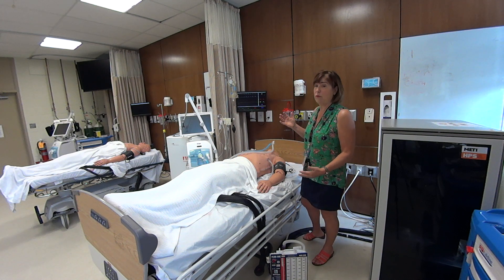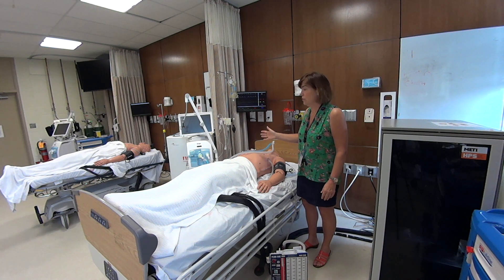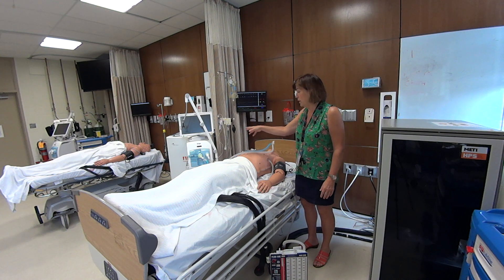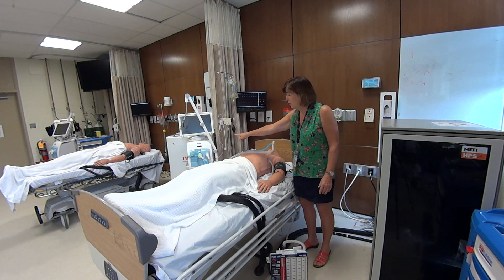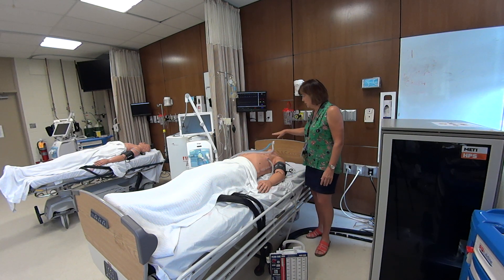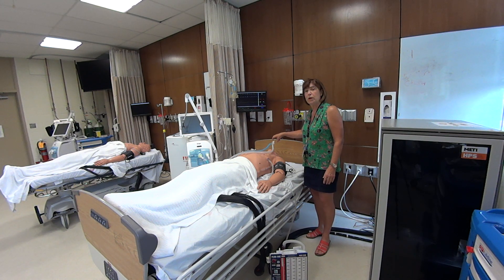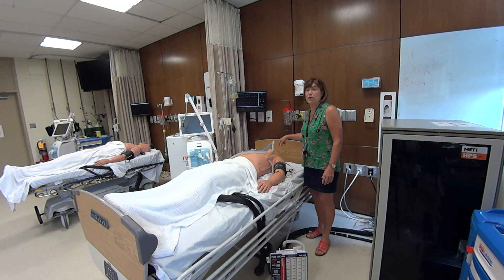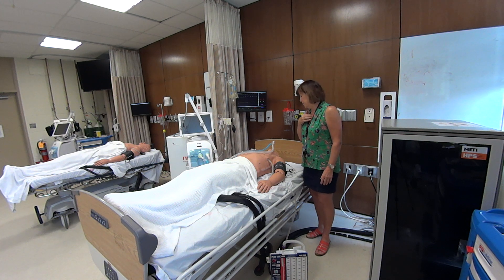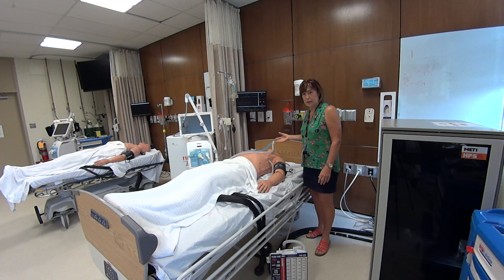The big piece over on the other side of the bed is the ventilator. This ventilator is not turned on, but you will see a ventilator similar to this — sometimes even a bigger one. You will see that they always have tubes that run from the ventilator, two tubes that come up and attach to the patient's endotracheal tube. That tube is going down into the trachea and sitting just above the divide of the lungs, the carina, and it is actually putting pressurized air into the lungs.